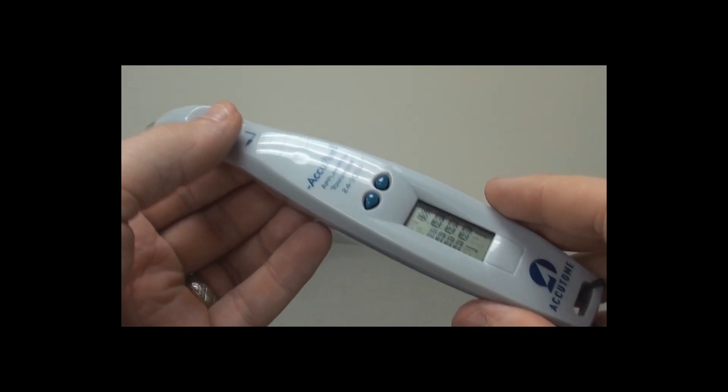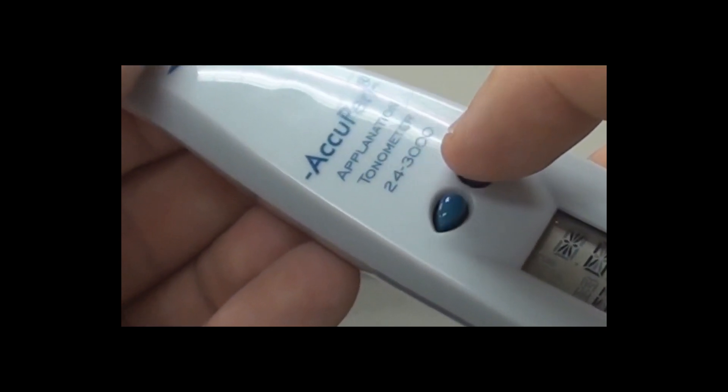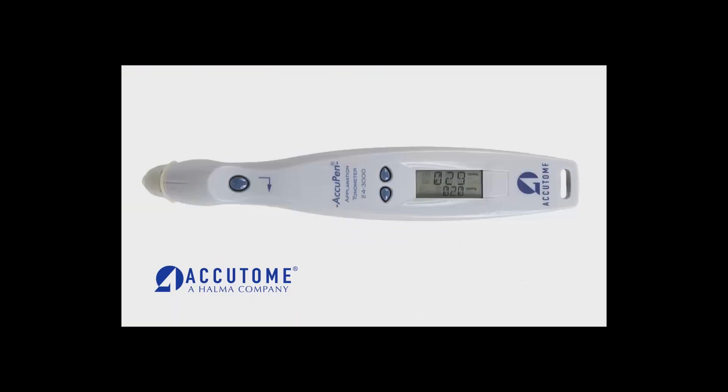To delete individual measurements, hold down one of the arrow buttons for approximately three seconds. The unit will chirp indicating the measurement on the screen has been deleted. After deleting one measurement, the AccuPen will automatically update the average IOP measurement.